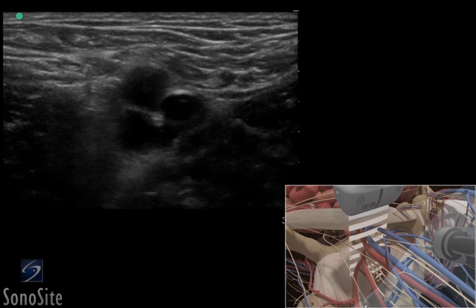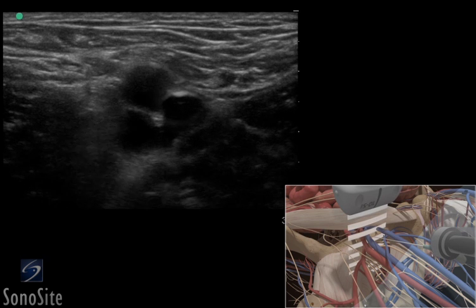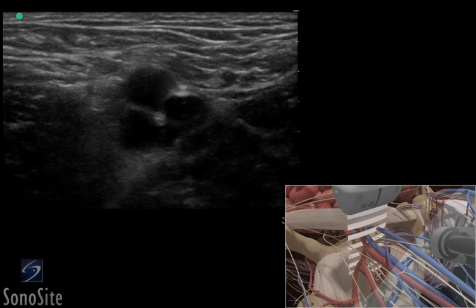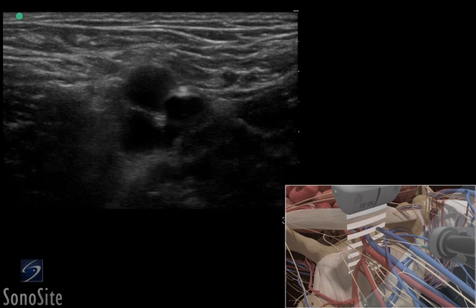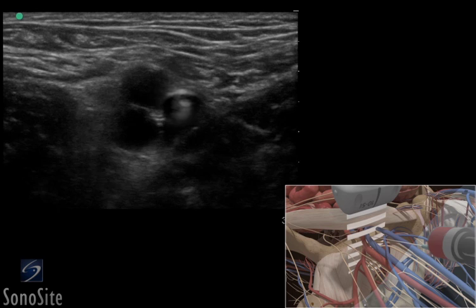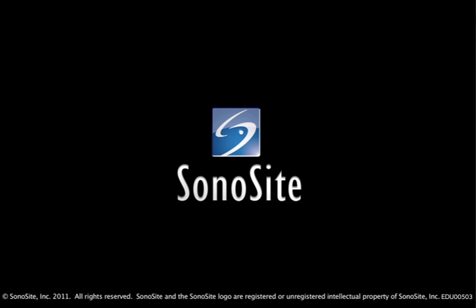Follow the needle entry by slowly sliding the transducer in the direction of needle advancement. The needle will appear as a small bright dot. When the needle tip appears, the transducer should be advanced a short distance distally to follow the tip of the needle trajectory. The needle is slowly advanced under direct ultrasound visualization until the tip is seen to indent and then puncture the femoral vein. The transducer should be moved slightly proximally and distally to confirm that the needle tip lies in the mid-portion of the femoral vein.